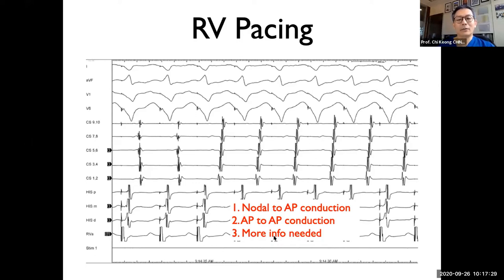Let me correct my English, the statement here. I mean, did it switch from nodal conduction to accessory pathway conduction, or switch from one pathway conduction to another pathway conduction? Please poll.